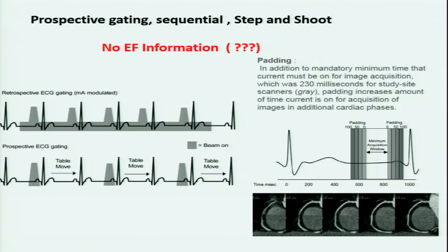Oh well. Okay, then, the other scanning mode is prospective gating. In the old days when we started prospective gating, the idea was to just have the detector on during a specific part of the cardiac cycle, for instance, 70% of the cardiac cycle. With the newer scanners, you can open up a window called padding. So instead of only scanning during the rotation time of 200 to 210 milliseconds, the gantry rotation time allows you to open up a little bit longer.